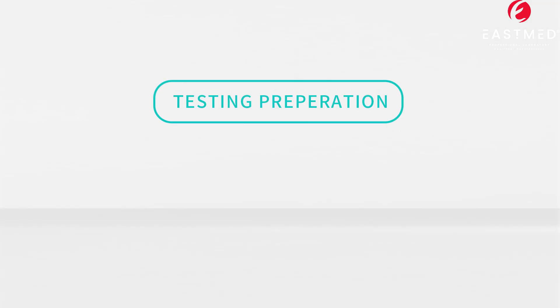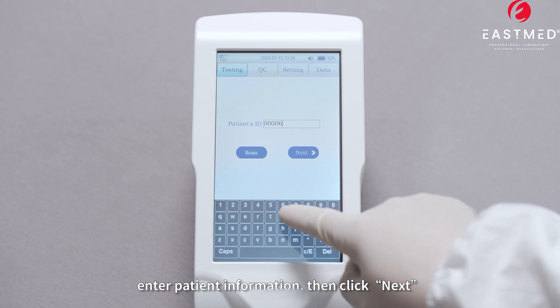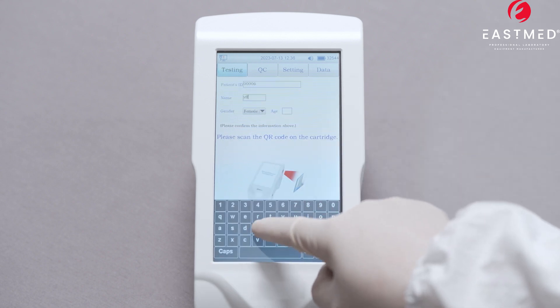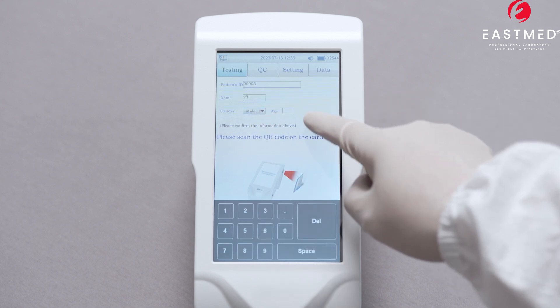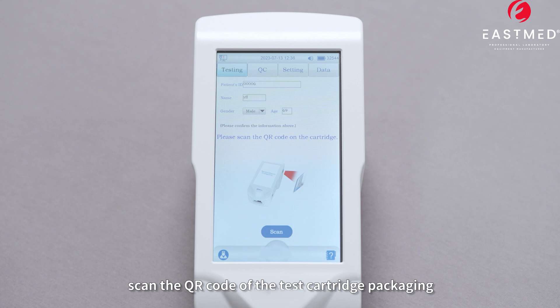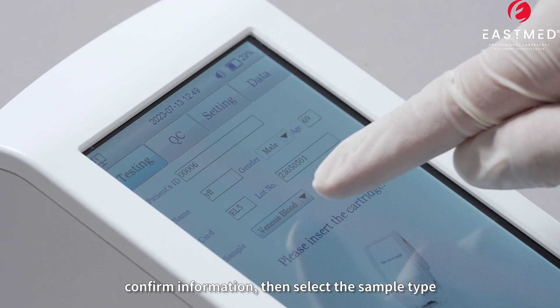Step 2: Testing Preparation. Enter patient information, then click Next. Scan the QR code of the test cartridge packaging. Confirm the information, then select the sample type.